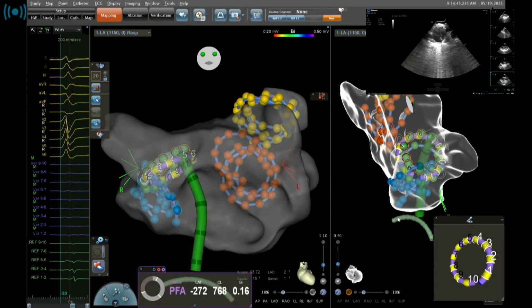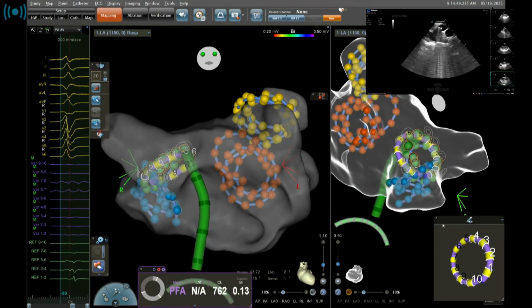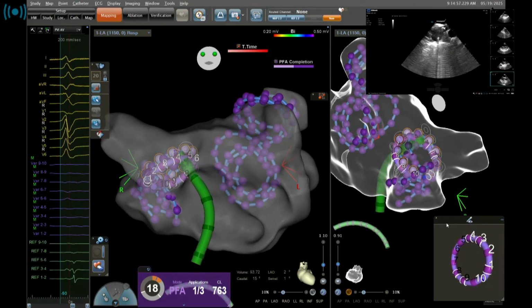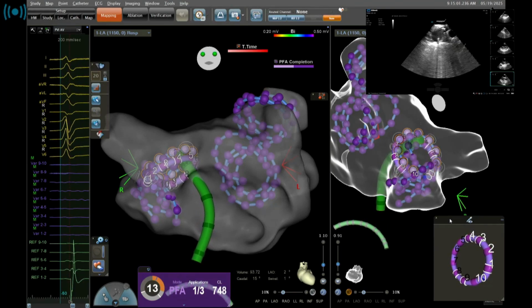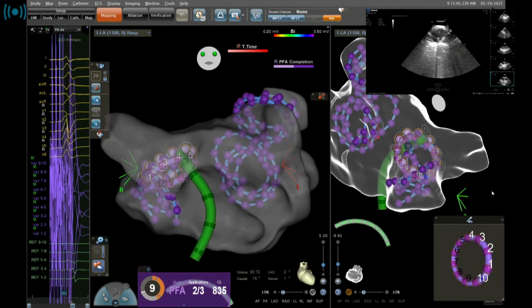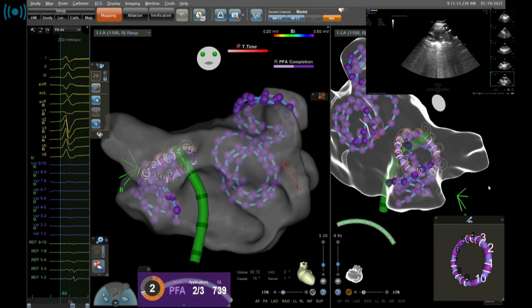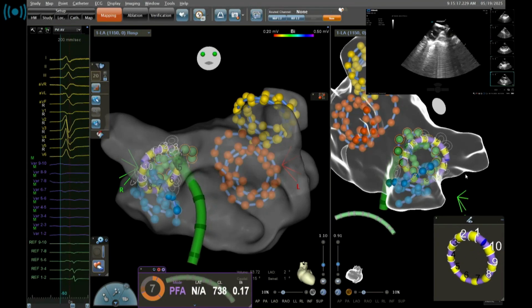One of the risks in right superior is to go out of axis. Now the axis is perfect. Okay, you can go. Because sometimes the electrodes number 1, 2, 3 go inside the vein, and the electrodes 7, 8, 9 are outside, and we go in the vein completely out of axis. So this is the only thing to pay attention to get a better ablation. Okay, I rotate. Okay, you can go.